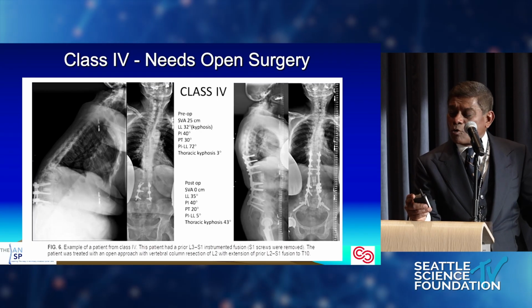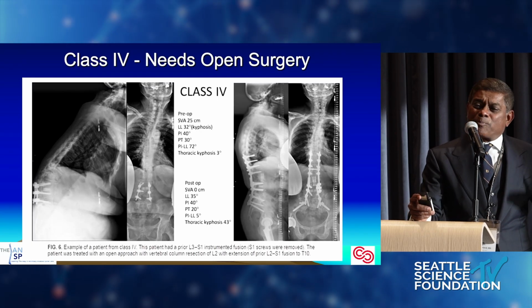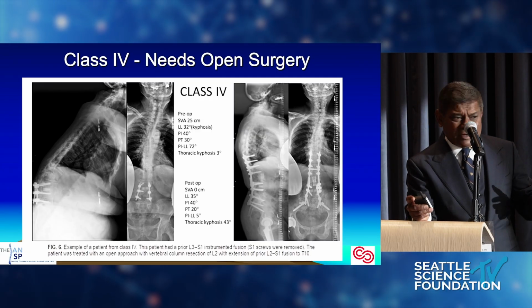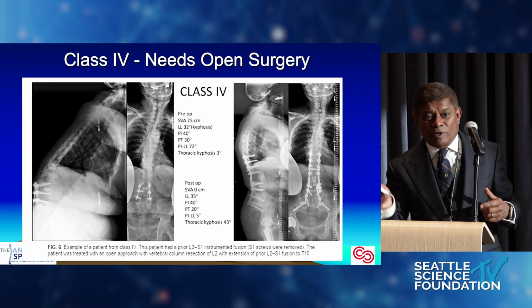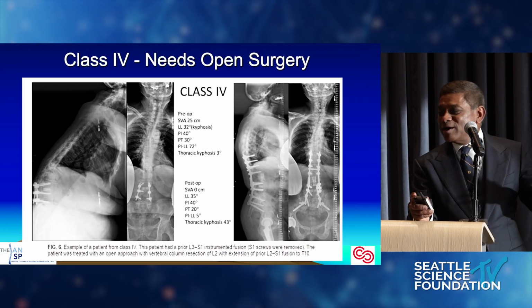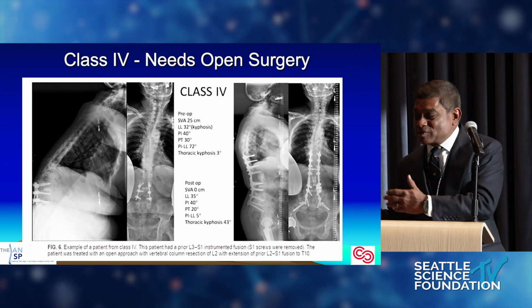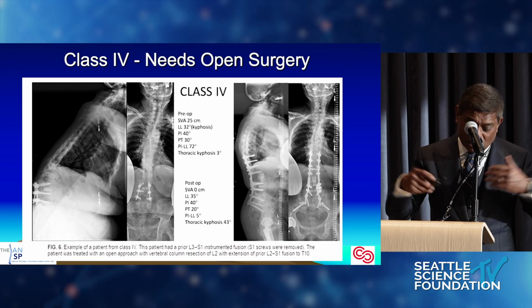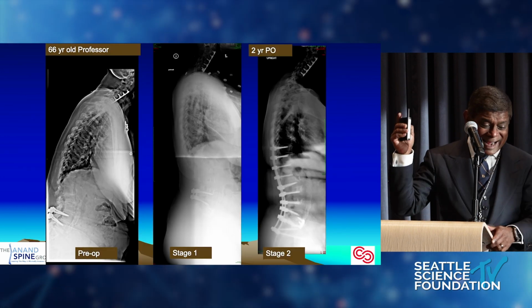Same with class 4. We routinely do patients with prior surgeries, incorporating MIS techniques, and I have another talk, I don't know which meeting, lots of meetings going on, that literally talks about when you have prior surgery, how we incorporate MIS in deformity. It's all about doing the principles, right? And what are the principles? Getting it all together: circumferentially MIS, attack the disc.